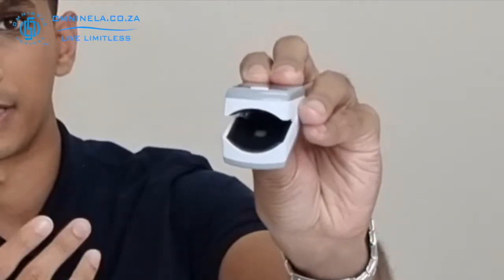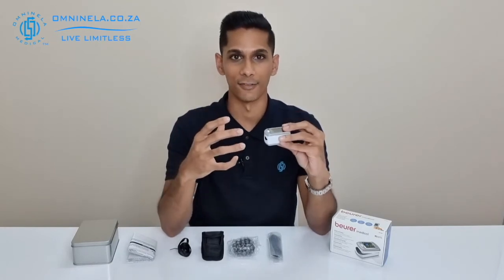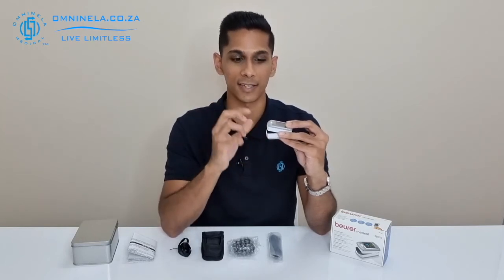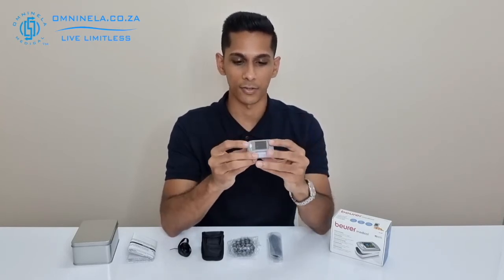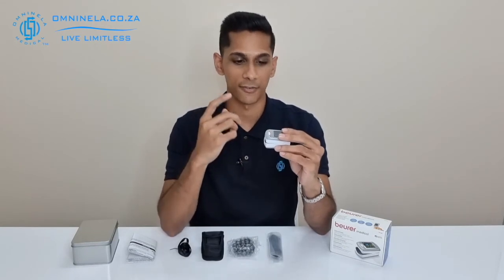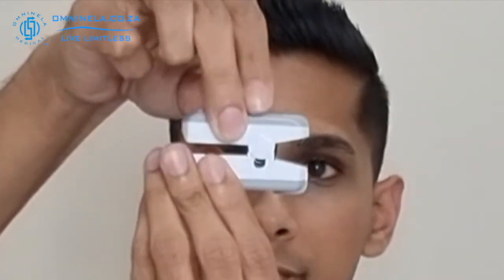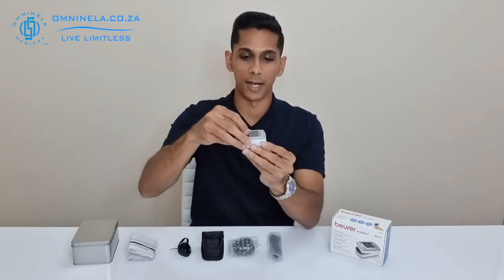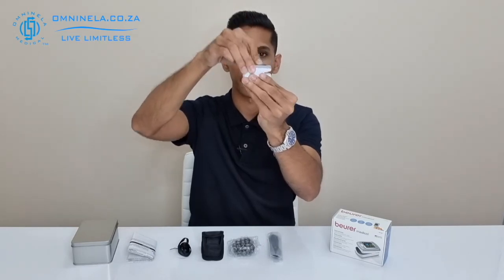We've also got an interior where your fingertip goes that has a rubber finish to it. This is nice because if you are going to be wearing it for a long period of time or if you have sensitive skin, a softer rubber finish on the inside is really worth it in the long run. On the PO80, if you have a larger finger, it not only opens in one direction but also in another, so if you have a thicker finger you can lift it up and onto your finger.